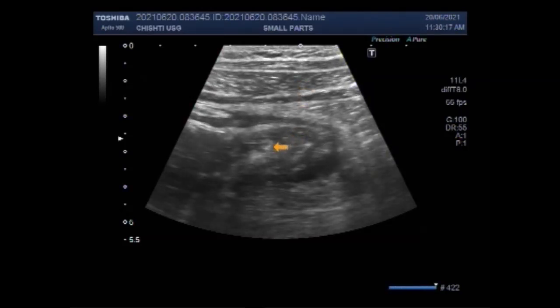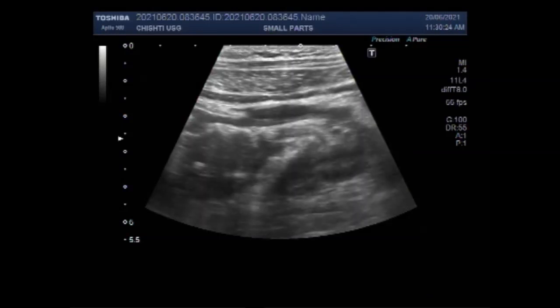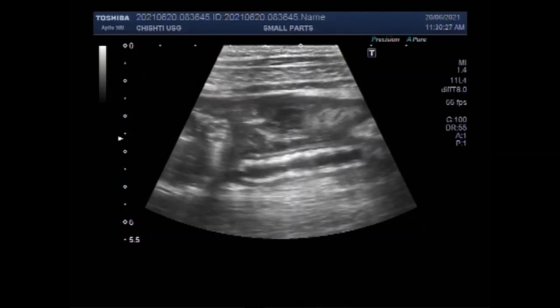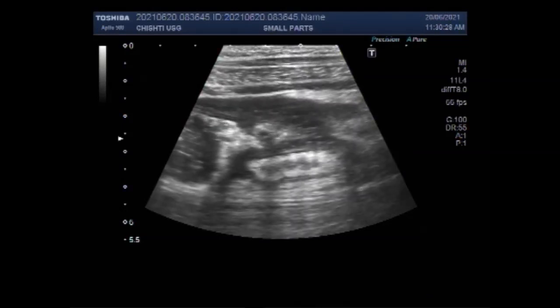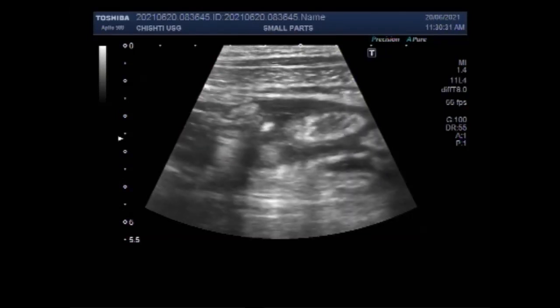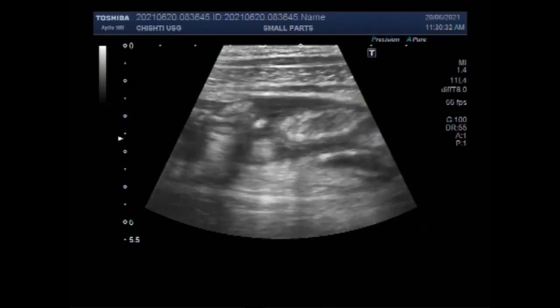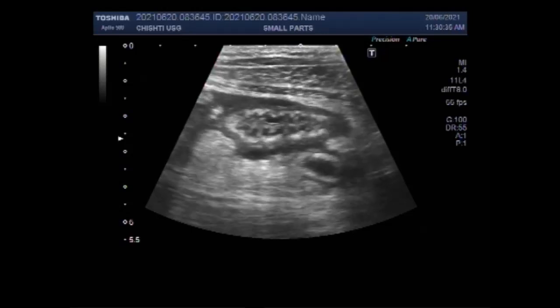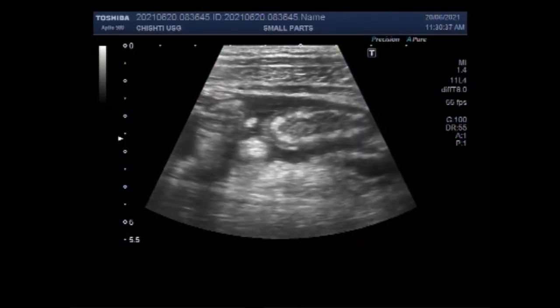As you have seen, I have traced the ascending colon. Now this is the cecum, and if you sweep the probe around this area, you can find the inflamed appendix. You can also see the fluid around these gut loops.